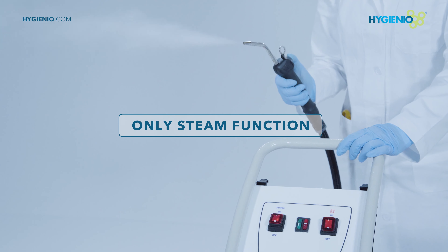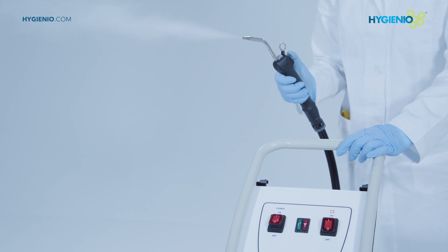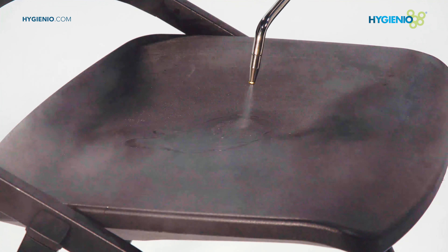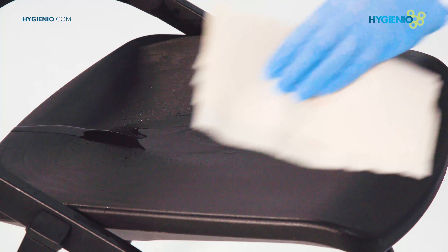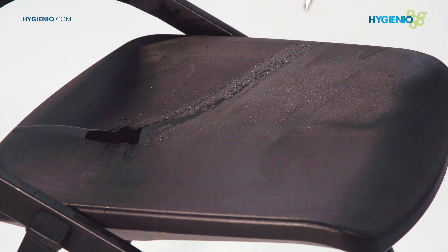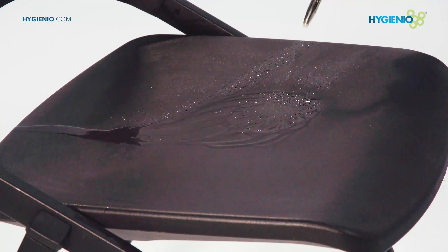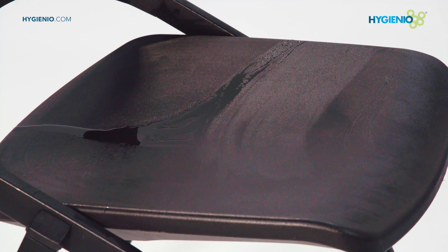Steam-only function. This optional function can be useful for a cleaning and deterging phase. In this phase, a short distance from the surface — 5 to 10 centimeters — can be maintained. This can cause excessive water residue; dry if necessary.